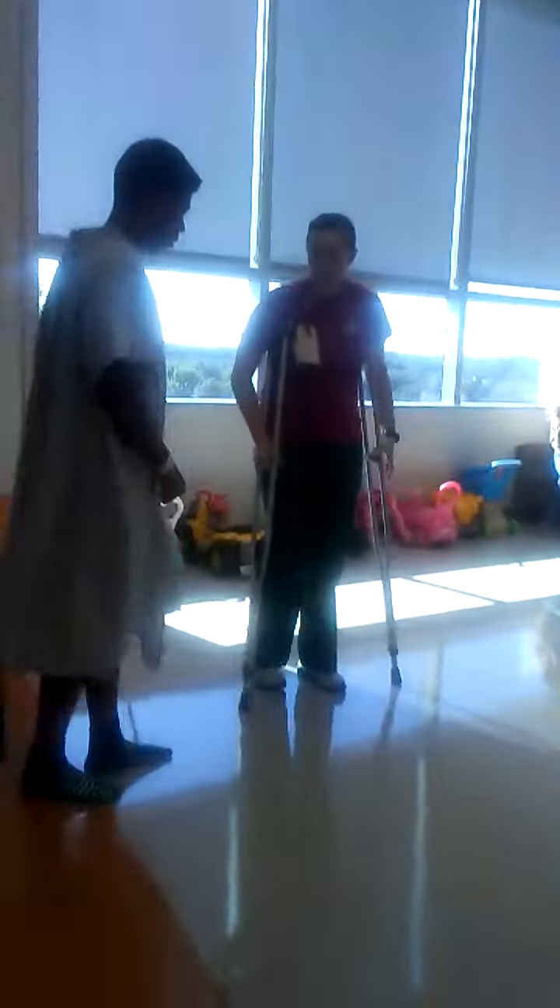All right, so we're going to go out here and hopefully that little guy didn't crash into us. This is our left knee. So we're going to take some crutches — if you don't put any weight in that leg, it's going to be crutches forward.